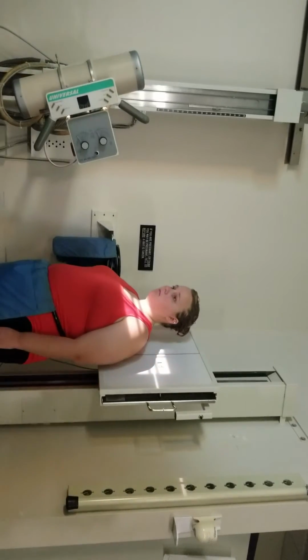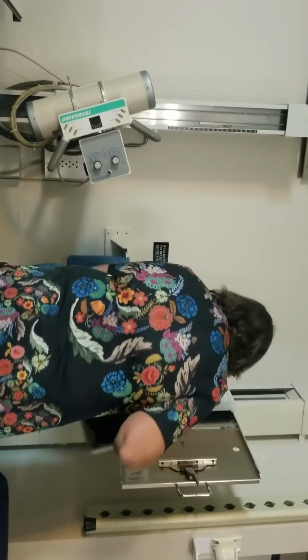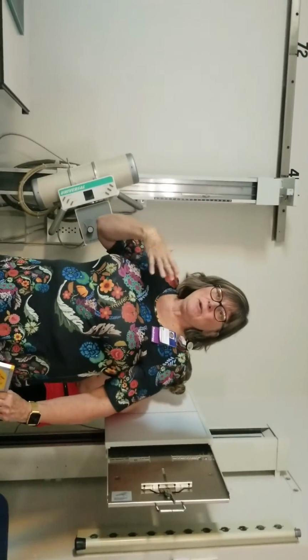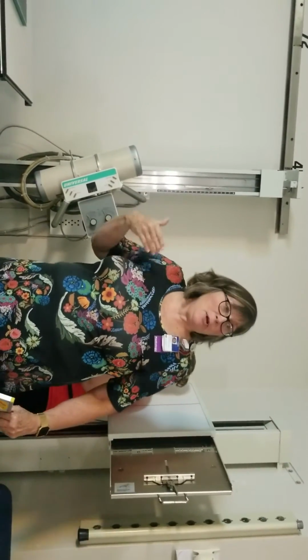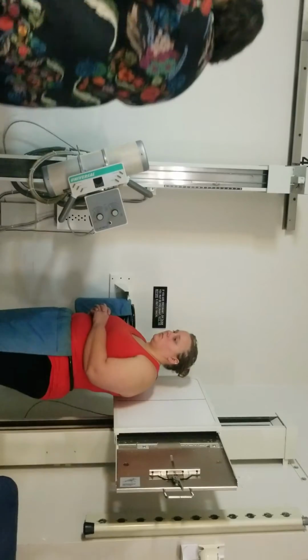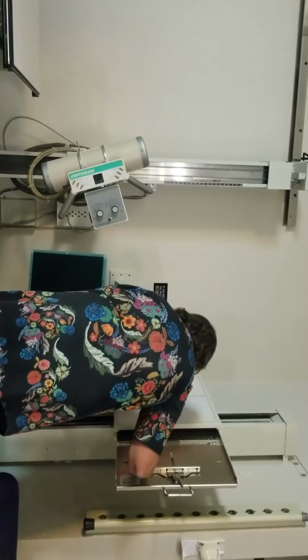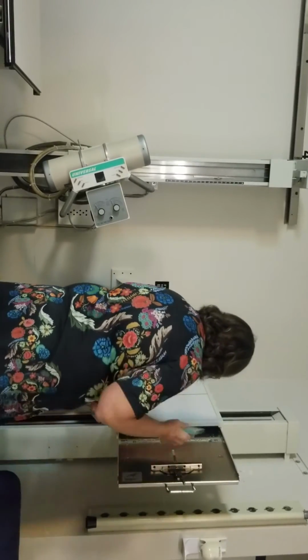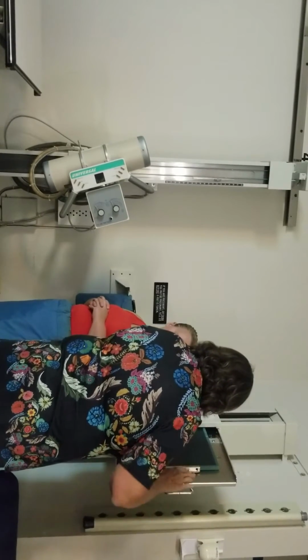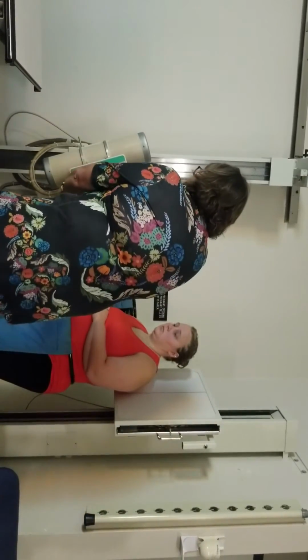Now I'm going to go to do the AC joints. We're almost done, Ellen. We got those special pictures of your joints to do. You guys remember what I said I was going to do with them? I'm going to try to get both AC joints on the same one. So since I want both, people are wide, I'm going to go to a 14 by 17 landscape. Okay? I'm going to take the angle off of my tube.